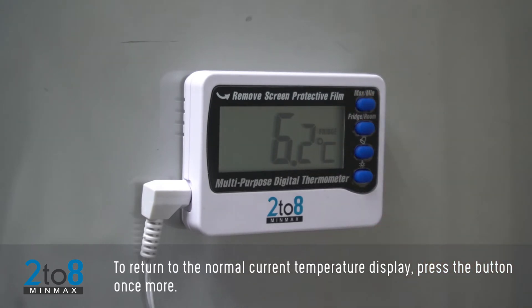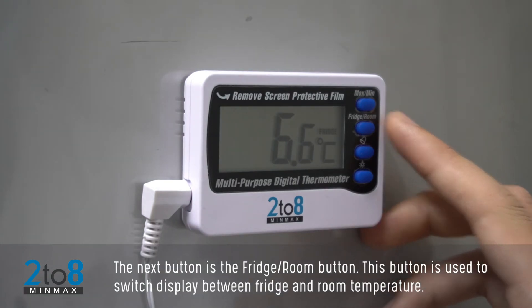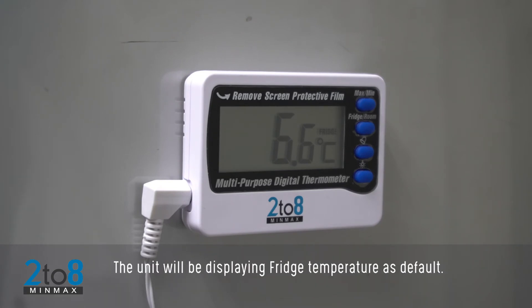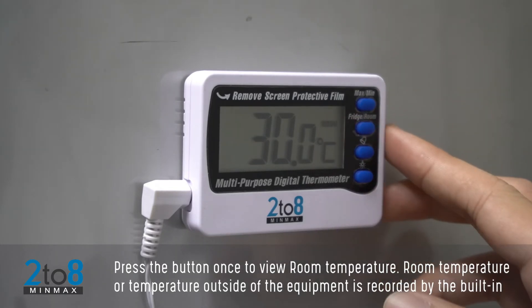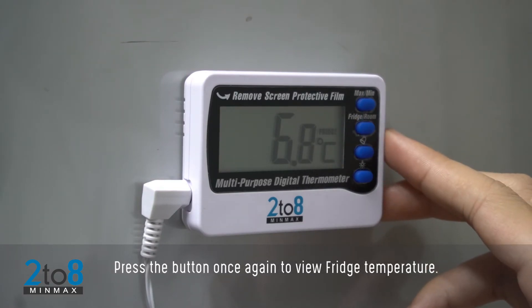The next button is the Fridge/Room button, used to switch the display between fridge and room temperature. The unit displays fridge temperature by default. Press the button once to view room temperature, which is recorded by the built-in internal sensor. Press the button once again to return to fridge temperature.